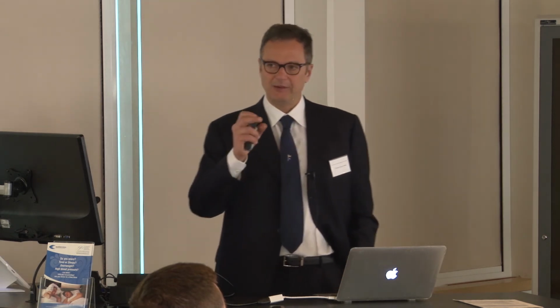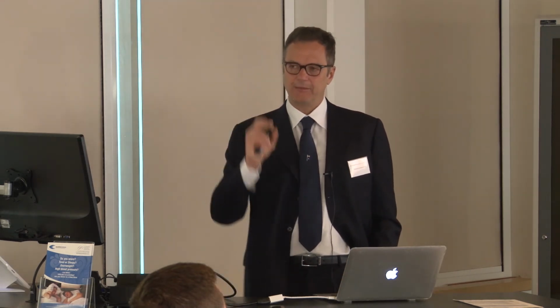For this reason, I suggest to perform these two chordectomies in case of limited lesions without involving the anterior commissure. But to be sure to have a clean margin, you have to follow very precisely all the steps of the workup that I showed you before.